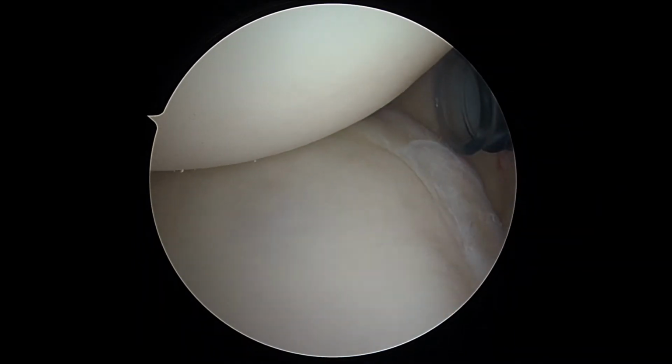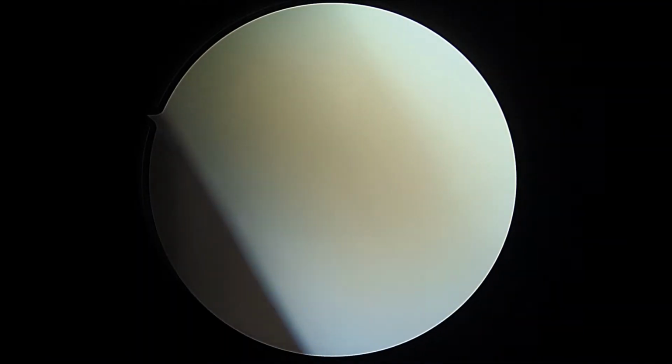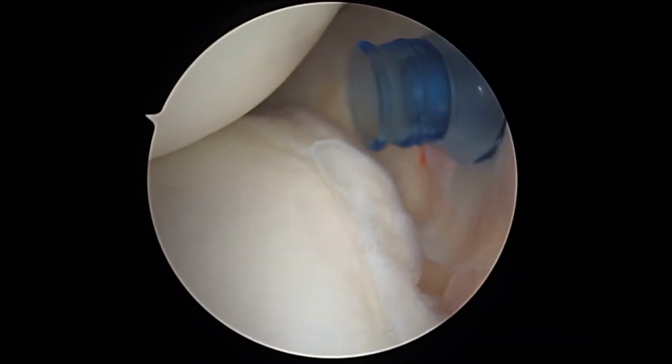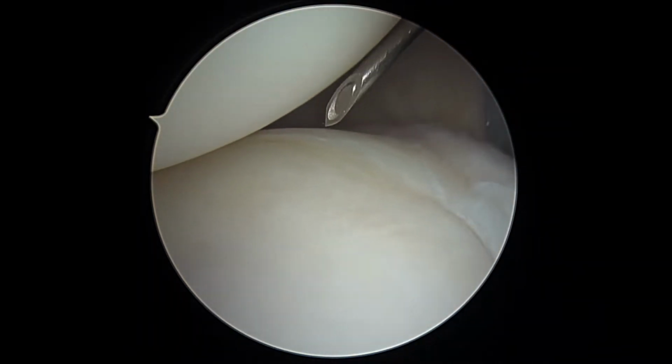We have another cannula coming in the front through a part of the shoulder called the rotator interval. You can see that right there. I'm going to slip the camera around behind the biceps. That's what we just did. And now we can see the posterior aspect of the joint. You can see this blue cannula coming in the back. So I've got a spinal needle coming down.